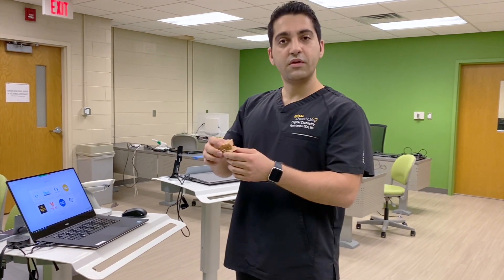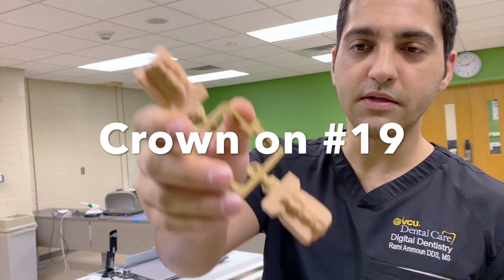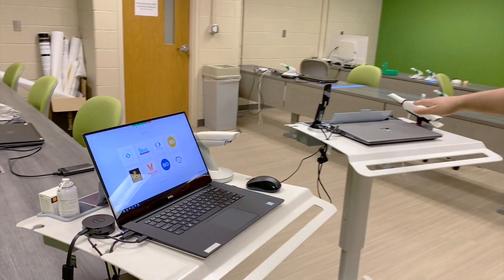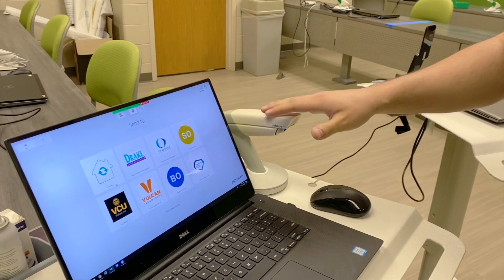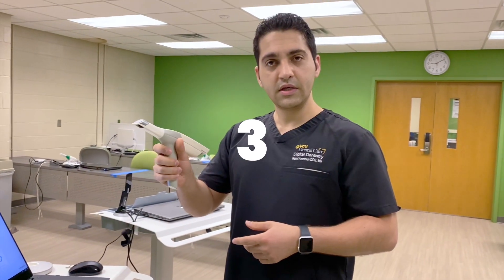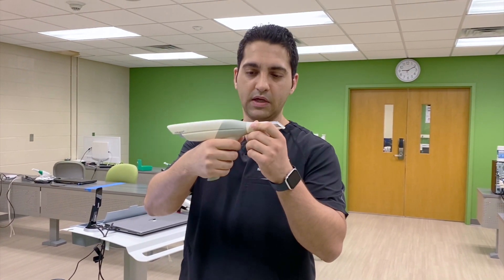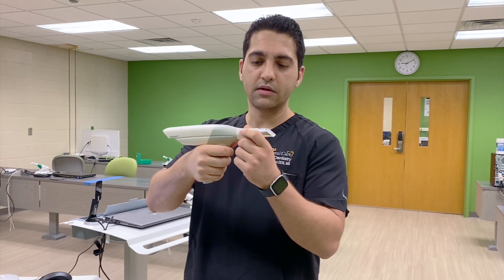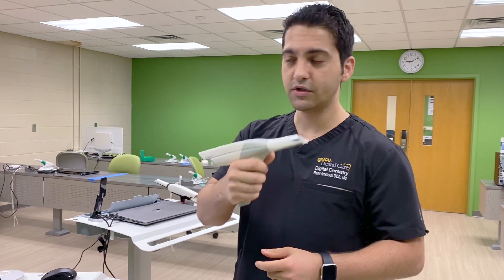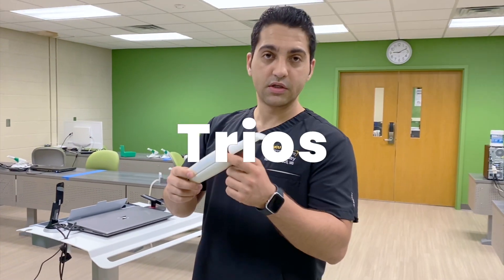So I have a model with me here that has a crown prep on it. I have both the scanners here. We have four scanners, but we have two types here. The Trios 3 is the first one that we use in the clinic. This scanner has a gun grip and the tip goes in and out like this. This is the Trios 3, and the other scanner we have is the Trios 4.